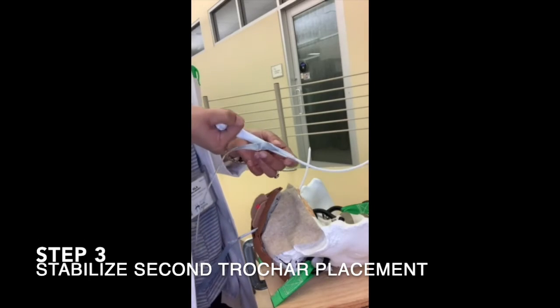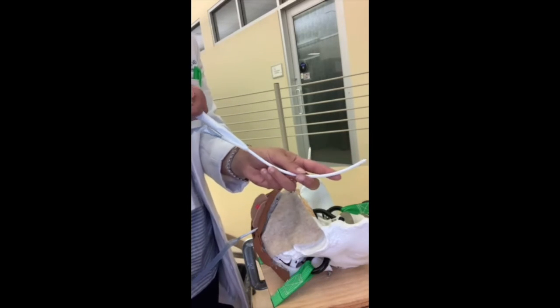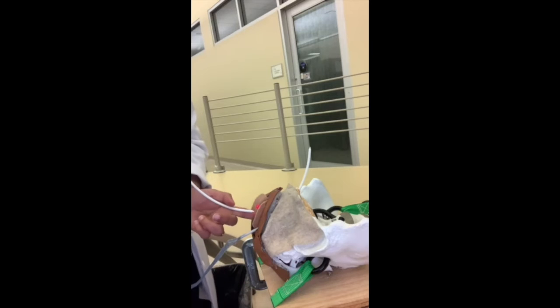You're not aiming lateral because then you can get blood vessels or nerves, and you're basically aiming towards the patient's ipsilateral shoulder. Again, dominant hand is holding the TVT trocar and your finger is guiding. So we are passing it through the dissection. My finger is pinching the trocar against the inferior pubic rami.